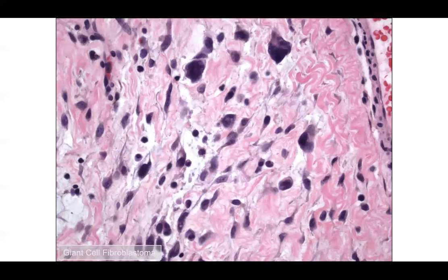Giant cell fibroblastoma, you can see these large giant cells interspersed among this highly collagenous stroma. Again, nothing about this tells you storiform or anything cartwheeling related, but it's essentially the same molecular underpinnings as a DFSP, interestingly.